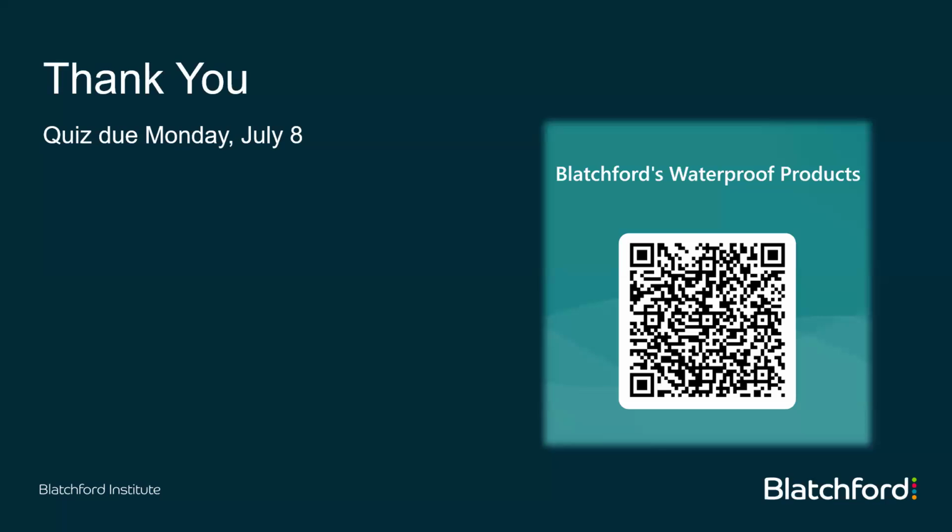Okay, so 7, he said, allows full extension. Not really sure what you mean by that. It does allow full extension, up until it's fully straight. It's got extension assist in the spring itself in the hydraulic cylinder, but then it's got extension dampening through the hydraulics to allow it to come to full extension. It can lock in full extension using the stirrup on the back of the cylinder itself. If that did not answer your question, feel free to reach out to me at mike.magee, M-A-G-E-E, at blatchfordus.com.